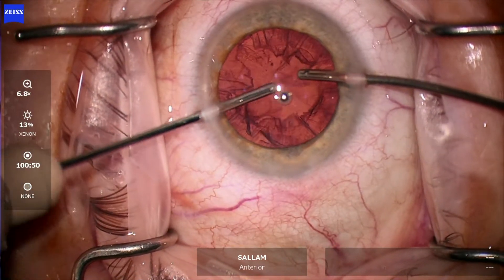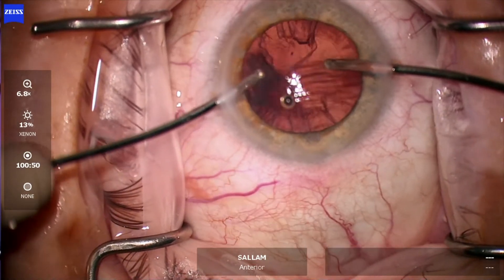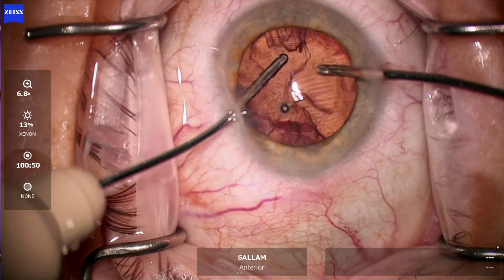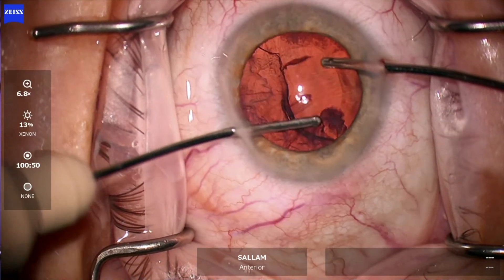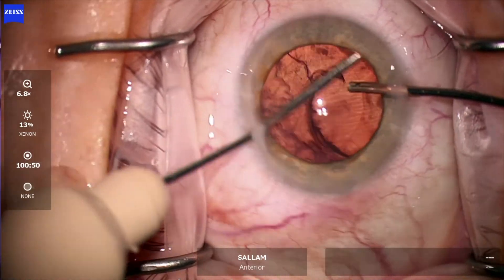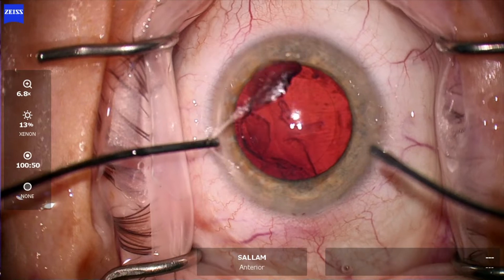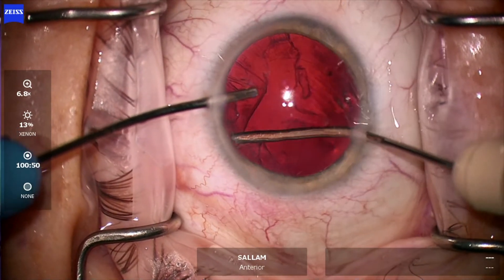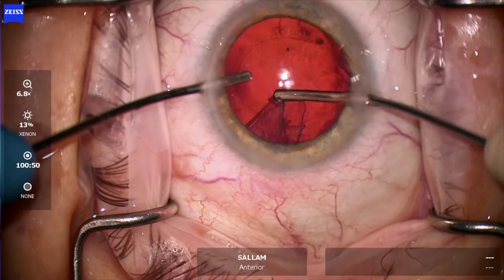Now bimanual irrigation-aspiration. A slight inefficiency here because I'm not able to get big chunks. The way to get big chunks is to do transverse or horizontal movements as you grasp the cortex — it's getting better. Now switching hands, going to the other side, trying to be more efficient and work on removing bigger chunks, which is working better. Then the last piece of cortex.